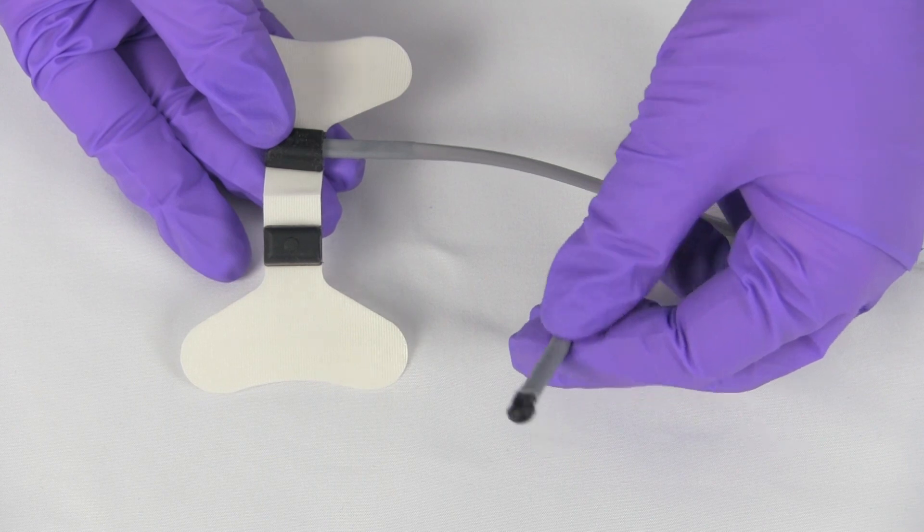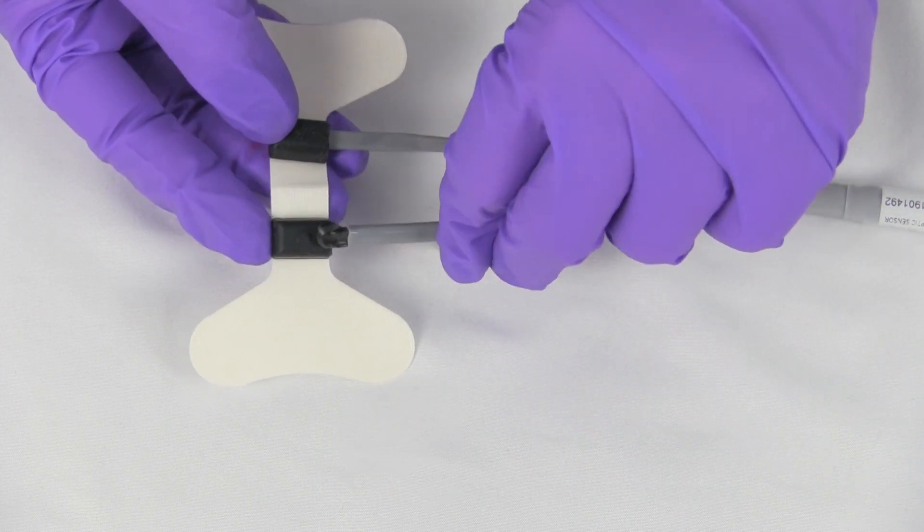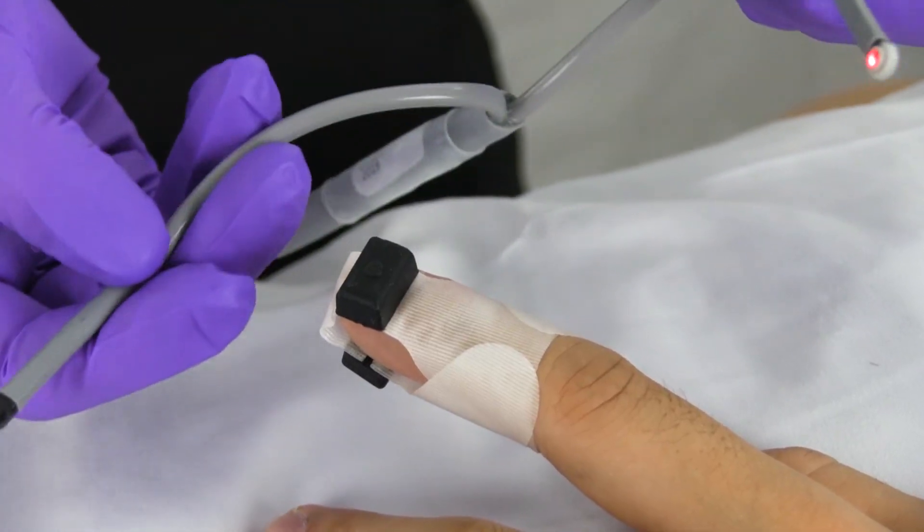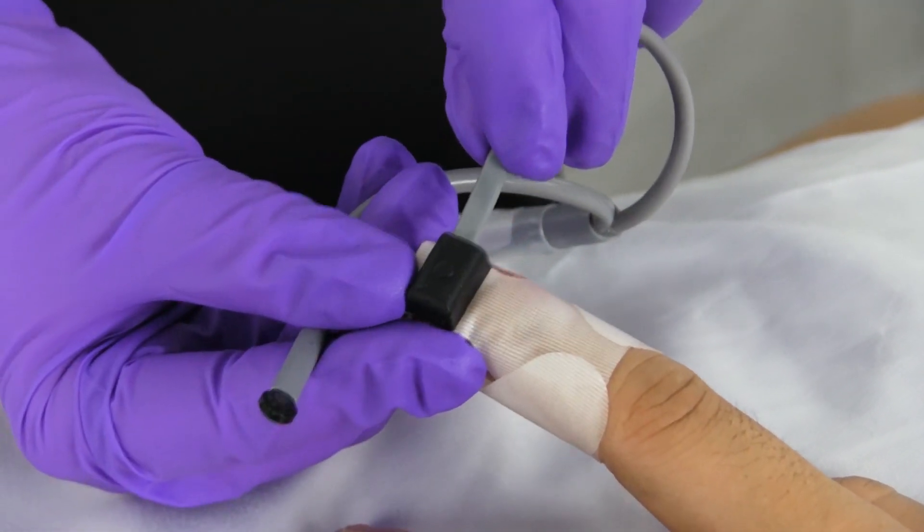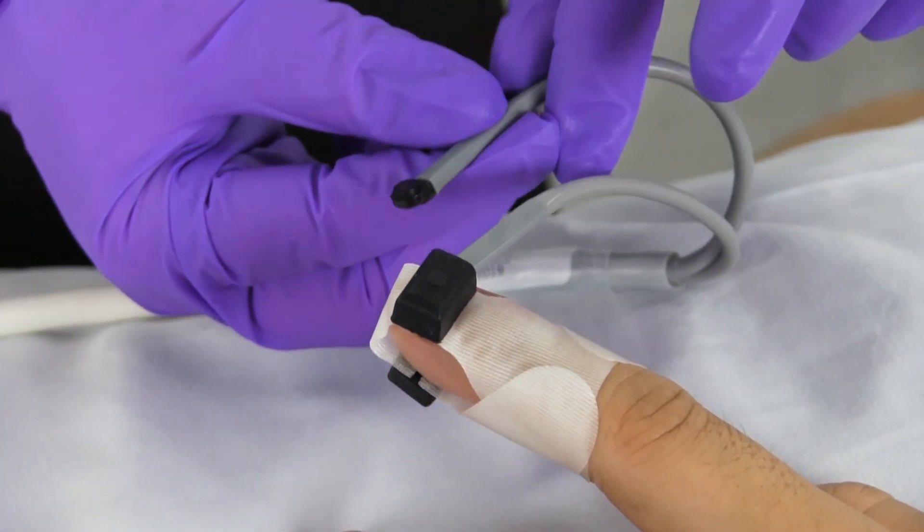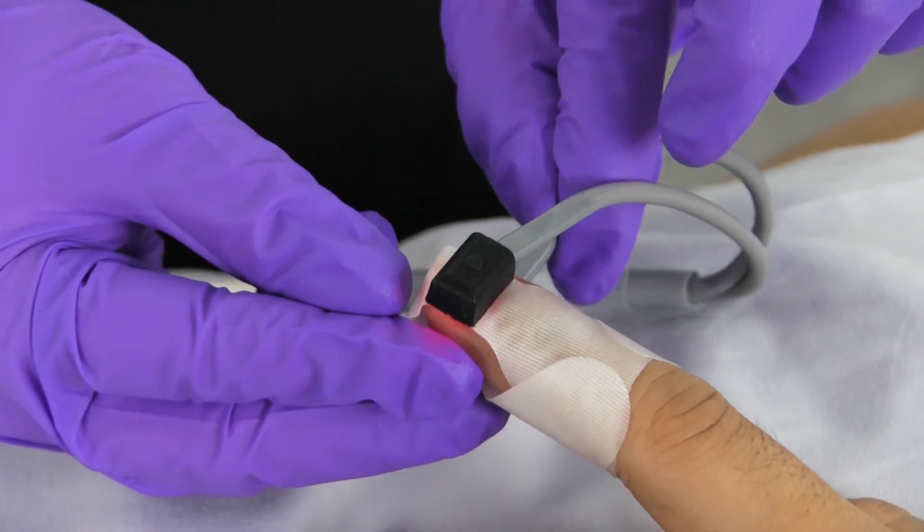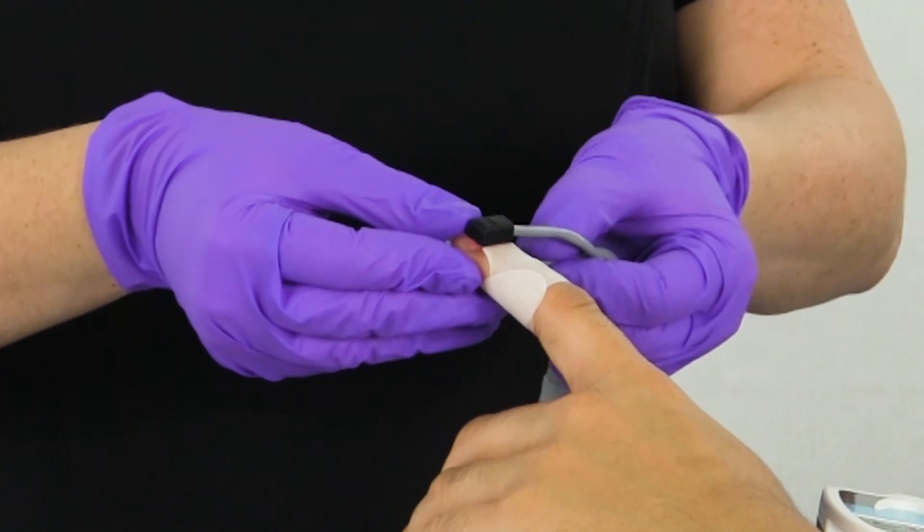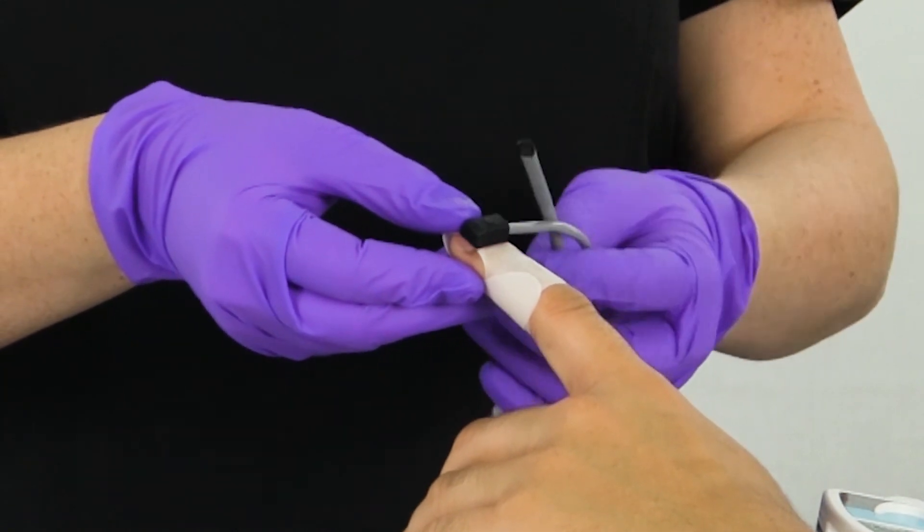Then, select the receiving fiber optic end and gently insert into the other receptacle. When changing out the grips, be careful not to pull from the fiber optics. The fiber optics can be fragile and over time can present problems with accuracy if they are damaged. Be sure to remove the grips by pulling from the same location as attaching the grips.